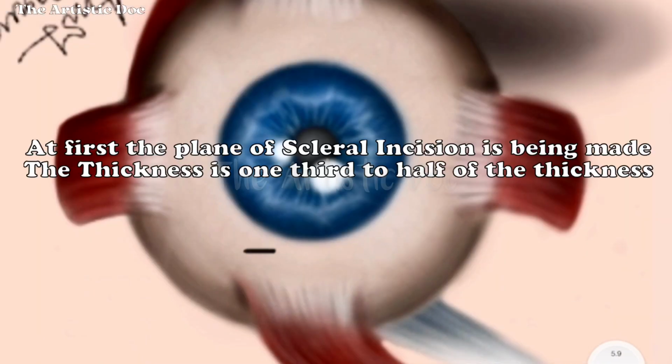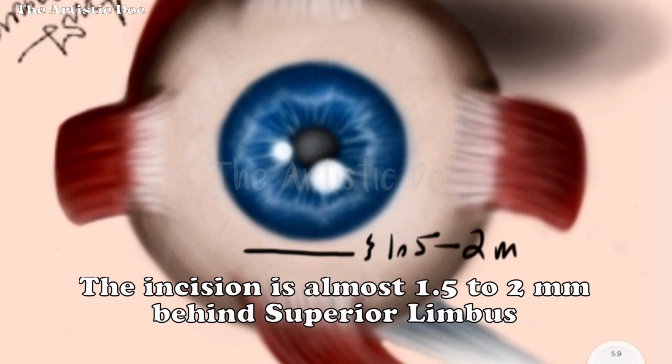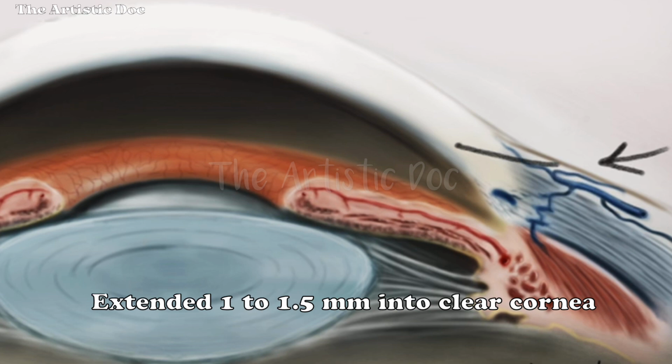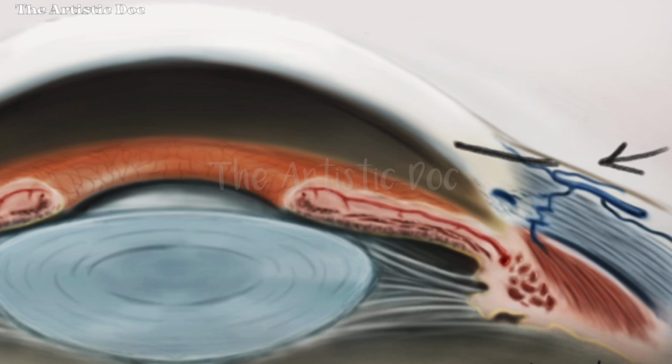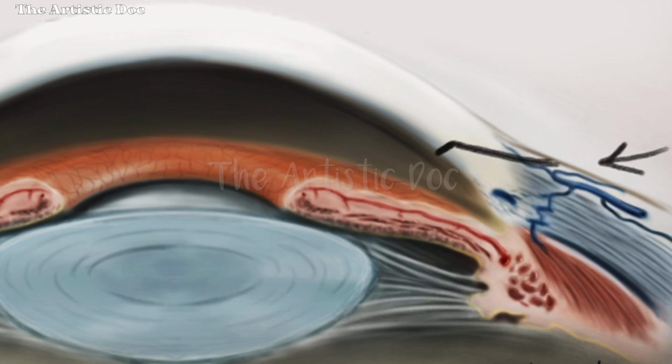Then the sclerocorneal tunnel is made. At first, 1/3 to half thickness scleral incision is made. See the course of the incision. Secondly, the sclerocorneal plane is extended almost 1 to 1.5 mm into clear cornea, and finally the tunnel is extended up to the anterior chamber by internal corneal incision using a keratome.